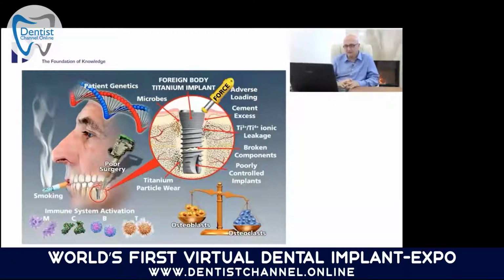And so we are not being informed about the real reasons. For example, you see up here, patient genetics can be the reason, smoking can be the reason. There's always a tendency in medicine to move the problem away from the treatment provider and away from the product. And there's always a tendency to explain to the patient, well, it's your fault. You were not compliant. You didn't do that. It's your bad genes, your bad grandmother, whatever. Always some kind of reason on the patient's side.